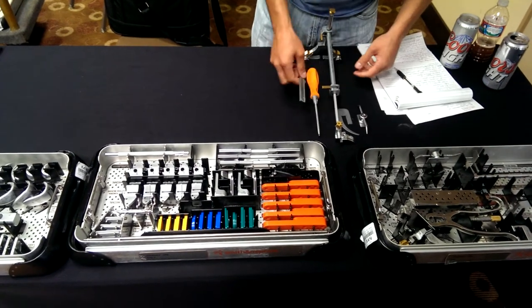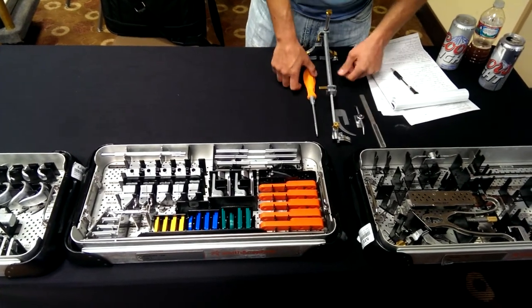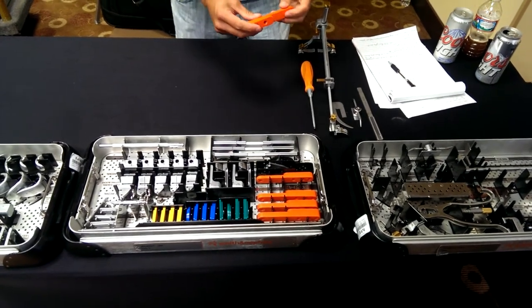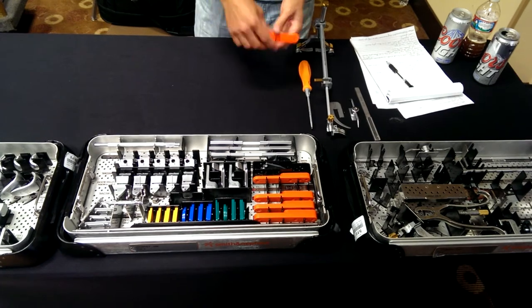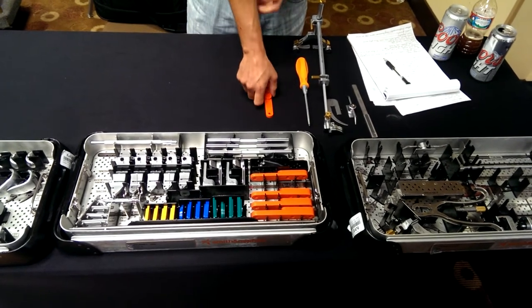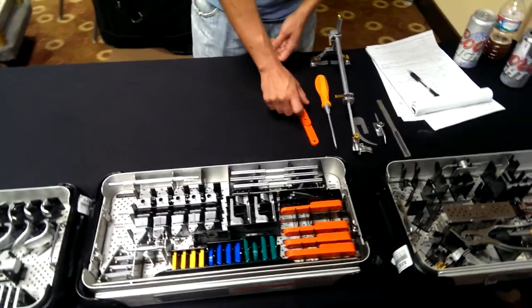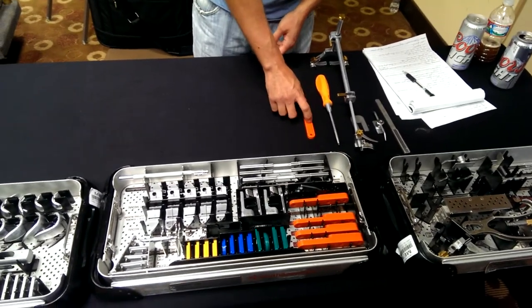We've got a bone rasp in case we've got to do a few clean-up cuts. And then after that we've got to start with a size 8 if we're doing a metal-backed size 8, because that's the lowest we have in metal-backed tibia. Polys, size 8, flexion-extension gap.